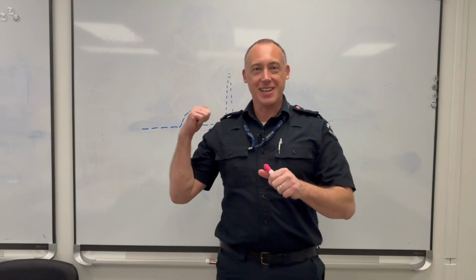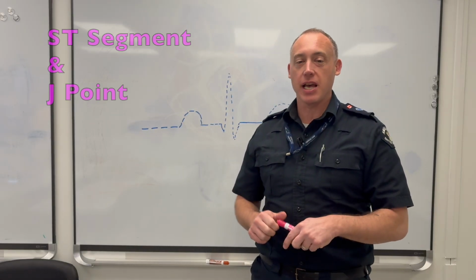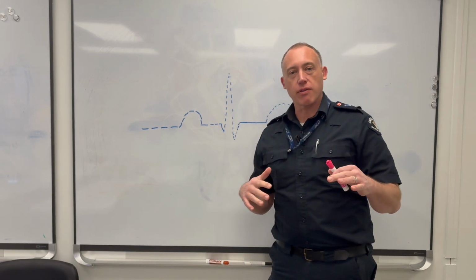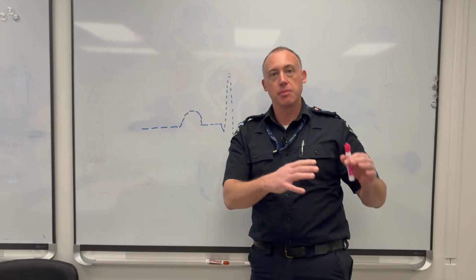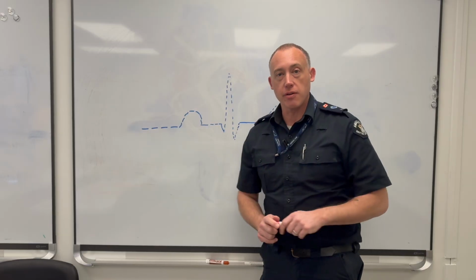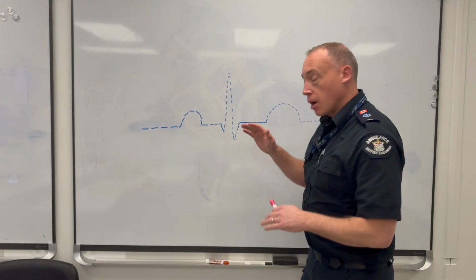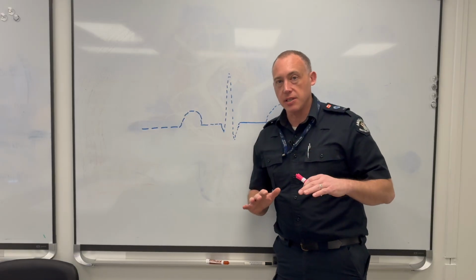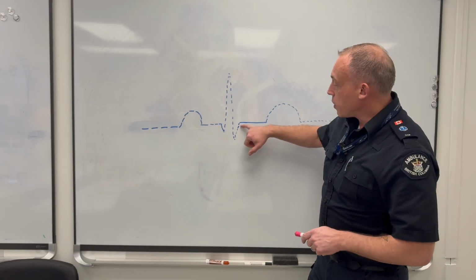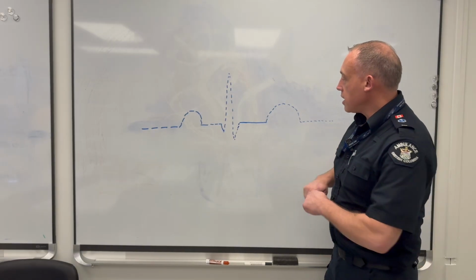Well, hey everybody, exciting. We've made it to the ST segment and we'll talk a little bit about the J point as well. This won't be long, we're just gonna cover it off and we'll talk about some of the problems and what this is associated with from a disease state in another video, because there's quite a bit to cover. But basically, I just want to define the ST segment. Might come as no surprise that the ST segment falls between the S wave and the T wave.